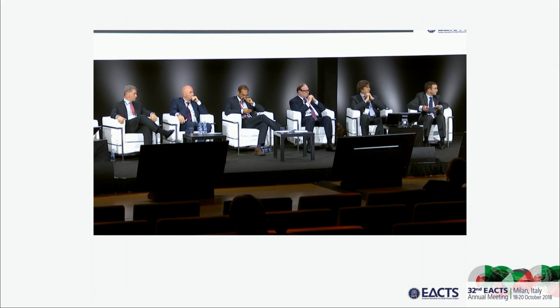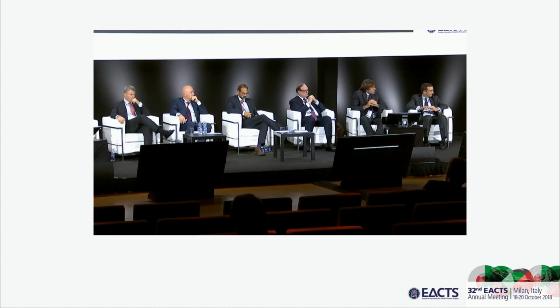Okay, thank you very much. Great presentation. Michael has proposed the alternative of... I think there is in the literature some of these TAVI done in the reimplantation, because with reimplantation, even with remodeling, we have a strong Dacron ring outside that also can compensate for the absence of calcification. What do you think, even with this high pressure?